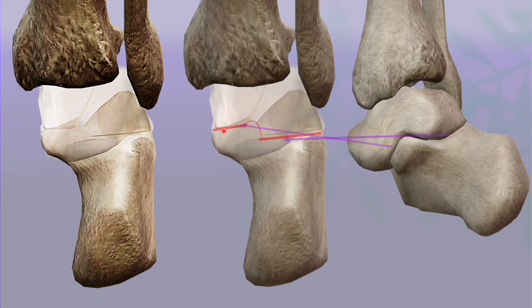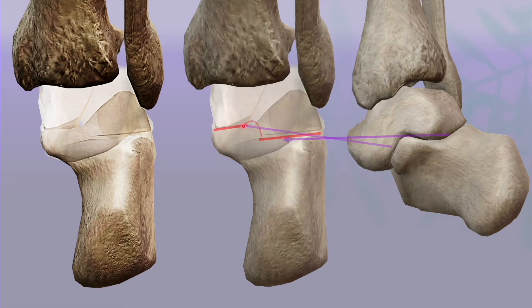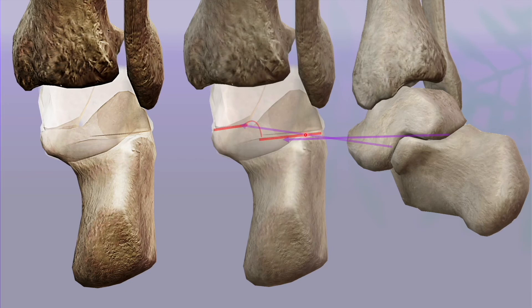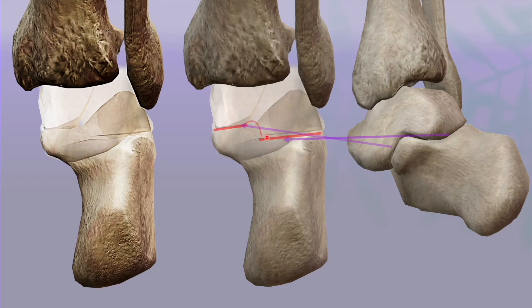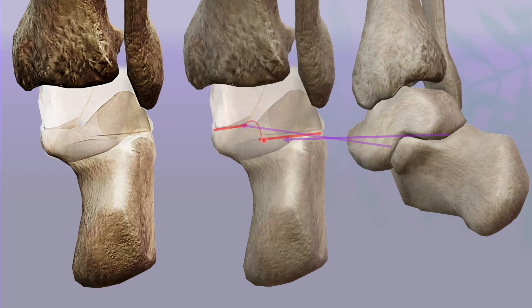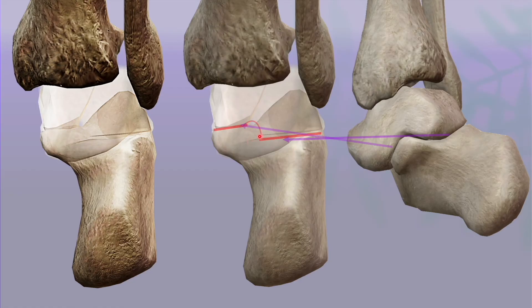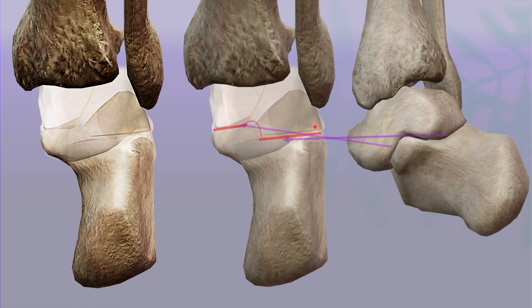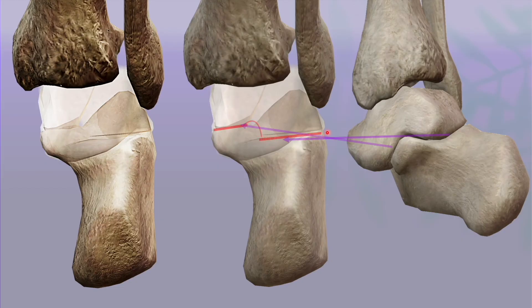Don't get confused when you see two parallel lines, because two parallel lines in different planes do not mean that the fracture is not reduced. You can tilt the fluoroscopic beam to get a view in which both appear in the same plane, but that's not required. Just focus on two things: there should be one line representing the undersurface of the talus, and there should be one line representing the posterior facet.